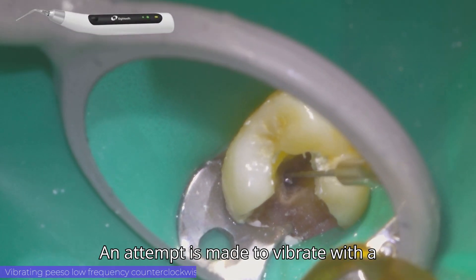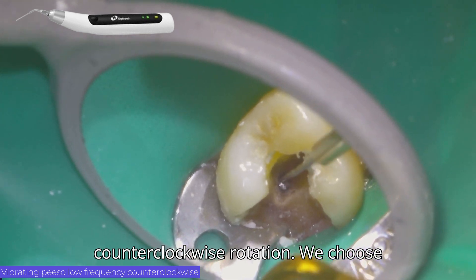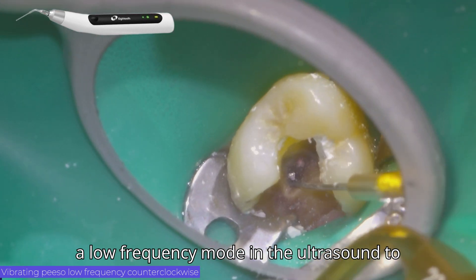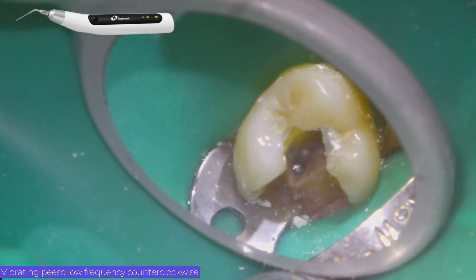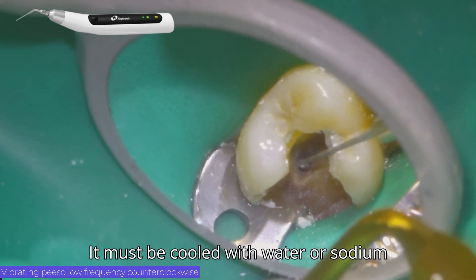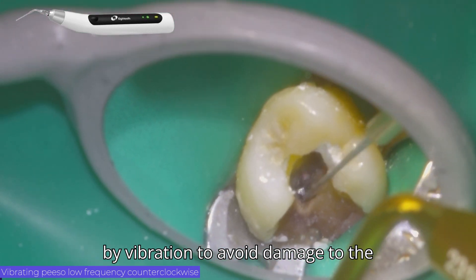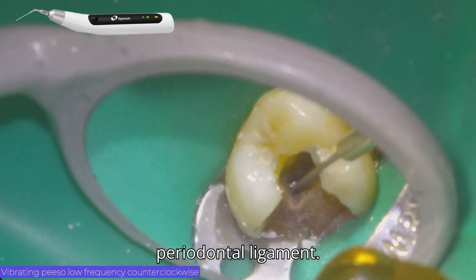An attempt is made to vibrate with a counterclockwise rotation. We choose a low frequency mode in the ultrasound to avoid unwanted scares. It must be cooled with water or sodium hypochlorite due to the heating generated by vibration, to avoid damage to the periodontal ligament.